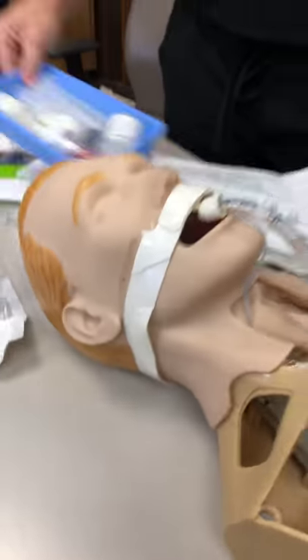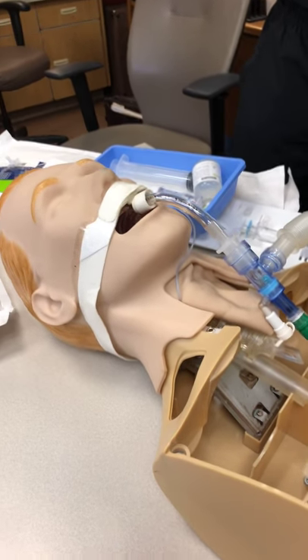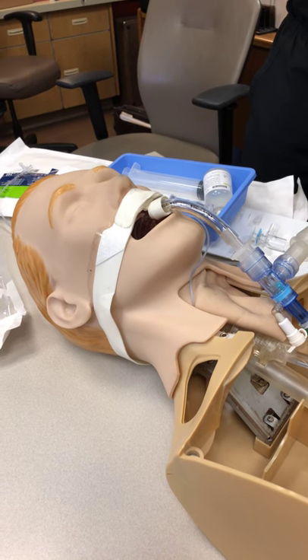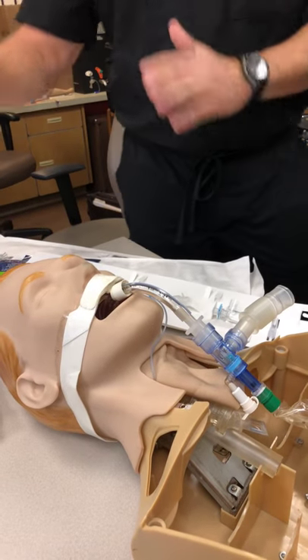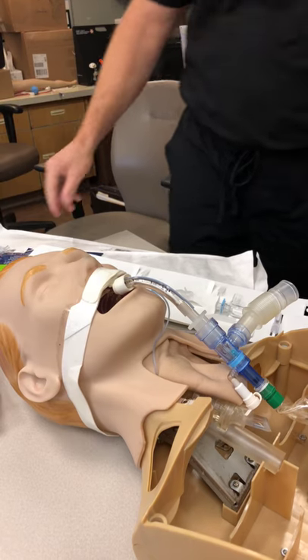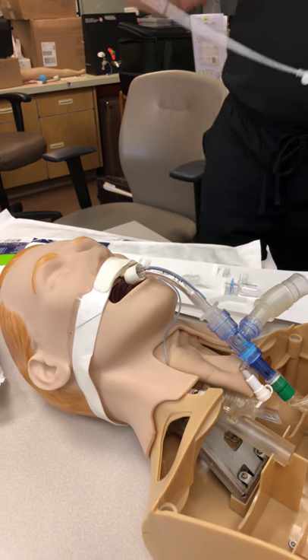If we did all that — Chris or John did all that — then we would be setting up for the mini-BAL procedure. After we go ahead and do the closed suction, we'd go ahead and pre-fill our syringes with 16 milliliters of sodium chloride. We'd get those set up and pushed aside. Then we would take our mini-BAL — it looks like this.